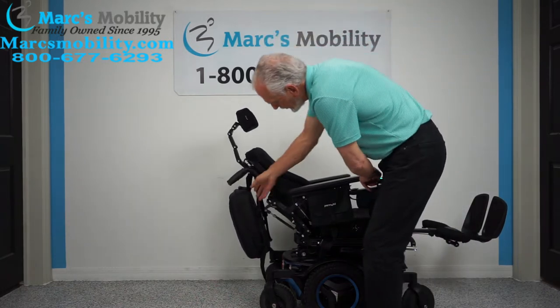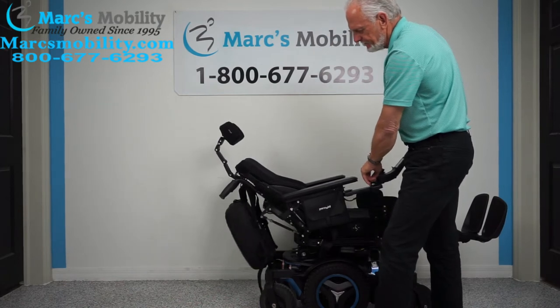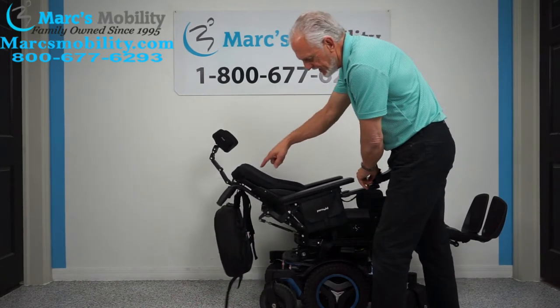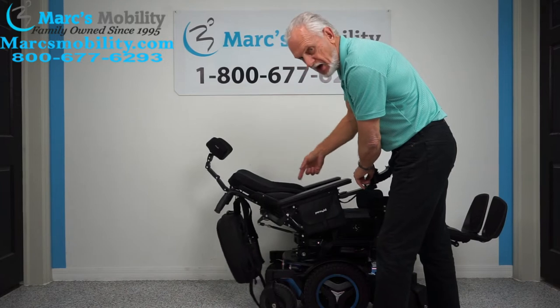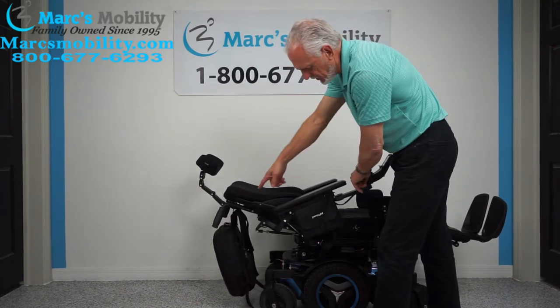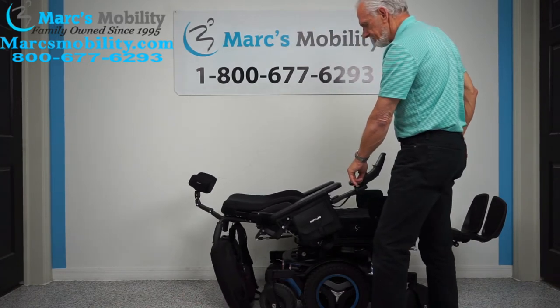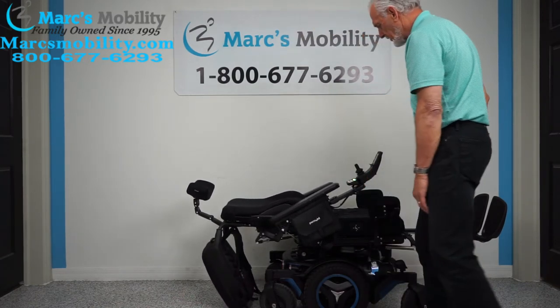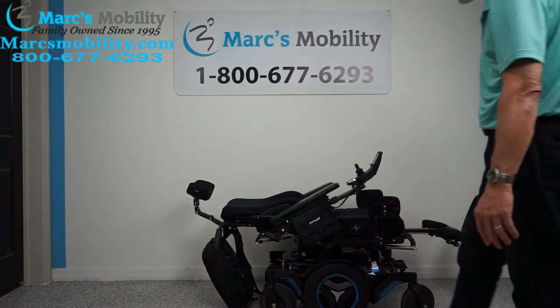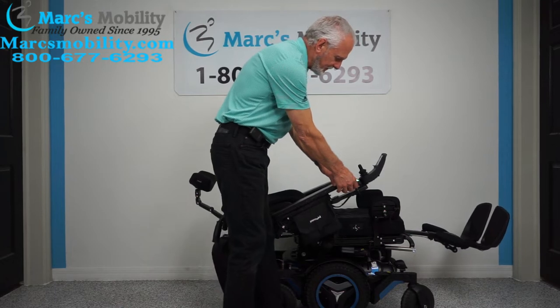When using the recline, make sure nothing gets caught up in there. I don't recommend keeping the bag on once you're reclining. This chair does come with the backpack. As you can see, this is a full recline — you're pretty much flat in this chair. Now I'm going to bring the recline up and the legs down at the same time by hitting two buttons at once.